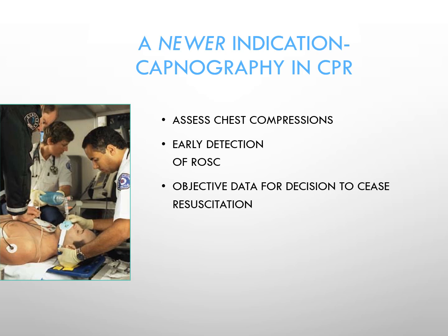So for example, if the end-tidal CO2 is exceptionally low, let's say less than 5 or 6 or 7, and it's been kept that way for a sustained period of time, it's suggestive that the blood circulation has been down for a long period of time, and that the likelihood of a successful resuscitation is not good.